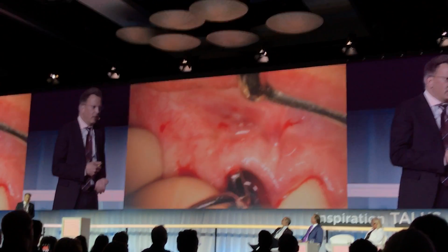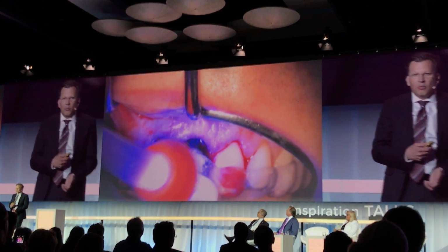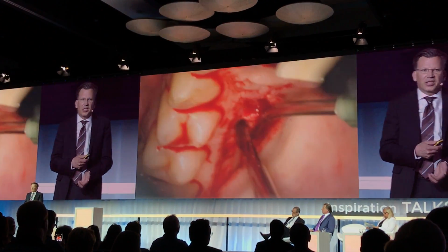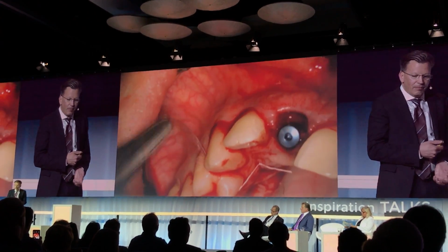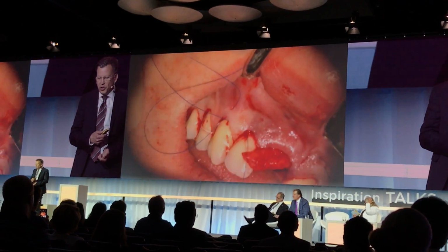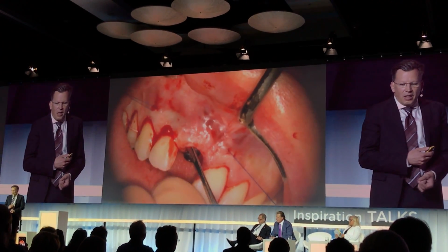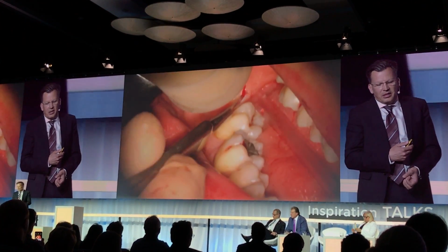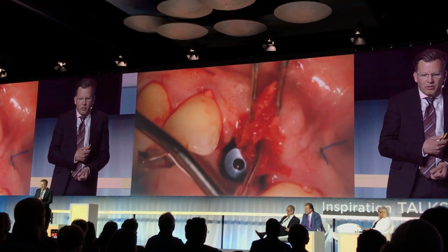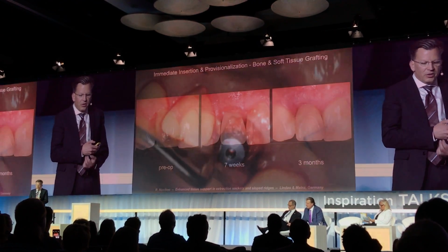Then we created a supraperiosteal tunnel in the buccal aspect according to Allen. We splinted our impression coping to our surgical guide, took some connective tissue harvested from the palate, and then we took the connective tissue into the tunnel and pushed it inside. Then we made a cut in the ramus area to get some bone chips with a micro safe scraper and grafted the facial defect with those chips.